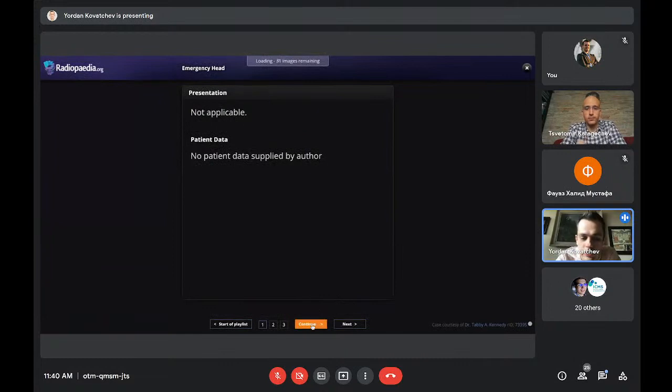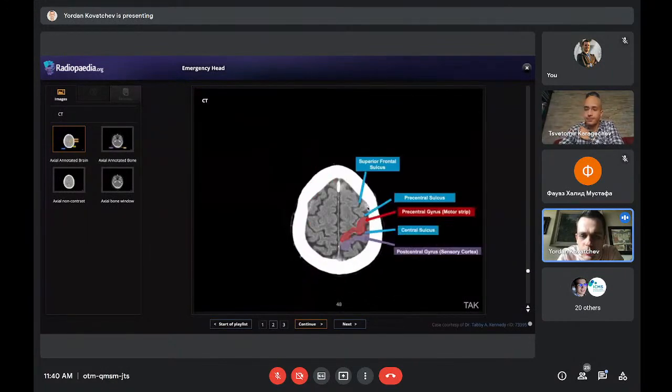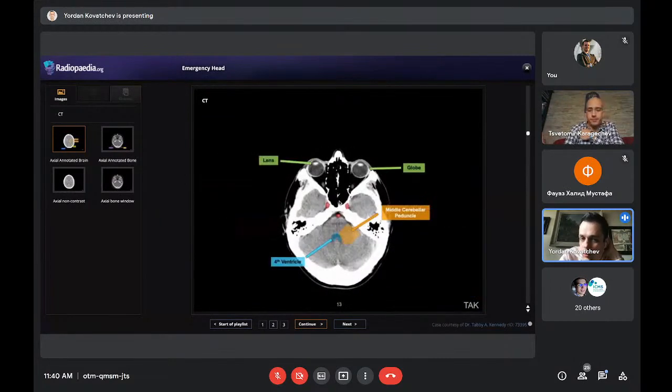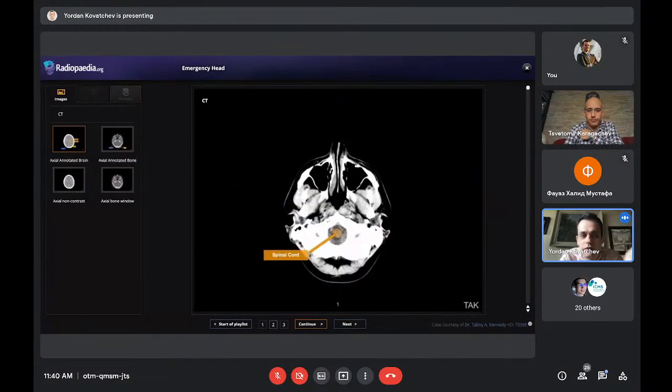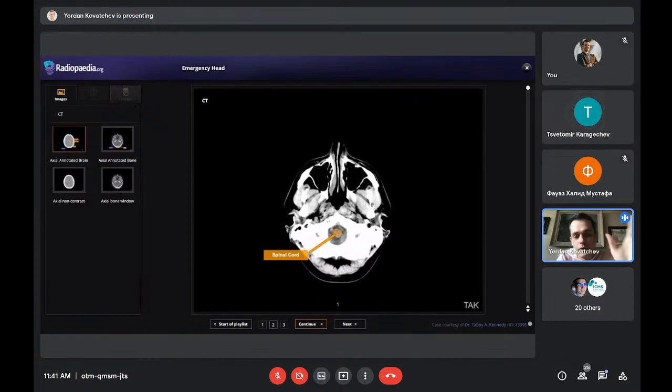Before we actually look at some patients, I will put into practice what I was telling you about now, the anatomy, and just go into a little bit more detail, because I don't expect you to know all this. I actually don't. I look at this and another graphic a few times a week just to remind myself of some details that I might forget. I really want to focus on that. It's really important. You have to know where to look for information. You don't have to know everything. It's impossible and just counterproductive. Try to think logically and try to look for the best source of information.